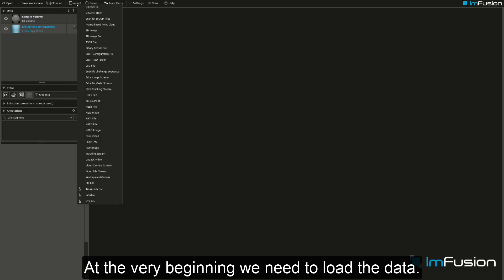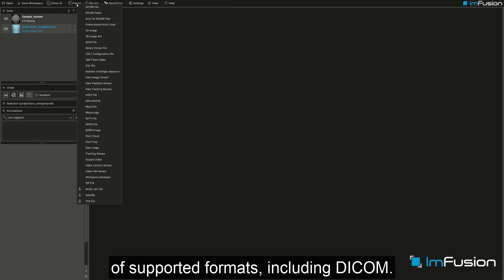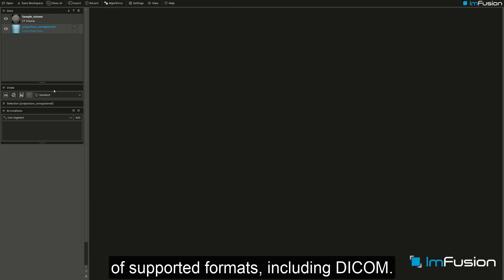At the very beginning we need to load the data. Our software comes with a broad variety of supported formats, including DICOM.